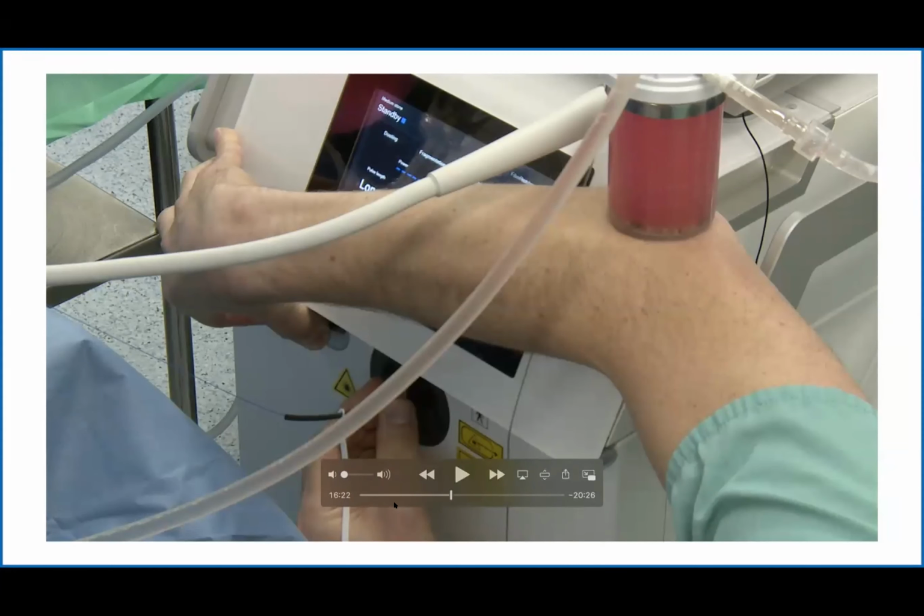I think people are doing more endoscopic combined. I think supine is certainly gaining positive feedback, and it's being adopted. And with supine, I think that the next step to do the endoscopic combined is much easier than if you're in the prone position. And more and more big centers now are offering a miniaturized approach with the advantages that Kasra's mentioned. So I think we'll expect to see that trend. So energy devices which help us to operate with a mini access are certainly going to be very helpful. I don't know what your thoughts are, Kasra, Laurian.